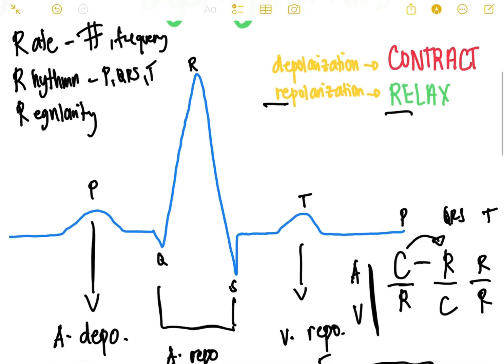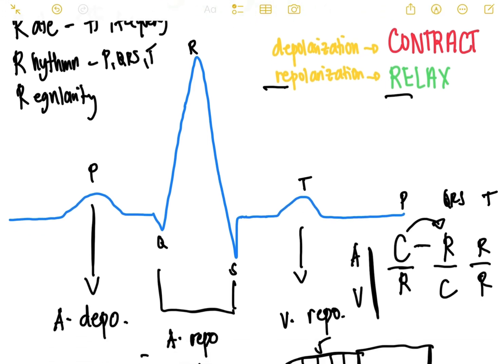Okay, eto na si PQRST. When you say rhythm, meron bang P wave? Meron bang QRS complex? Meron bang T wave? Yun si rhythm. Basta, pag sinabi natin rhythm, this refers to the arrangement or the completeness of the components of your ECG. So, P, QRS, T, meron ba silang lahat? At in order ba sila? Visible ba silang lahat? Normal ba sila?